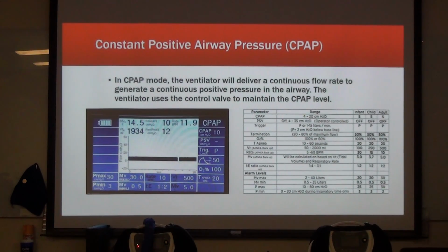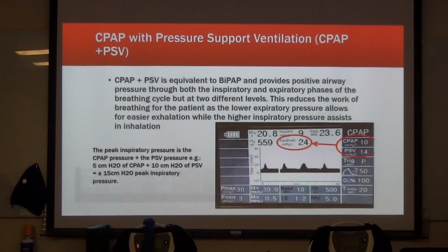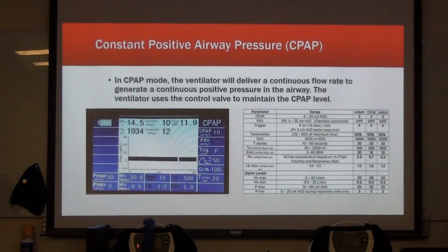So the thing is, this is just like what you have on the truck, but probably measuring it a little bit more efficiently, because you actually have a value that you're looking at here rather than a flow. So that's going to be a nice piece for you. And if you're wanting to, you have the ability to run this at 60% rather than 100%. So providing the same pressure, which is really what you're pushing for on this patient, if they're definitely like a CHFer, right? And then use your nitrates appropriately.